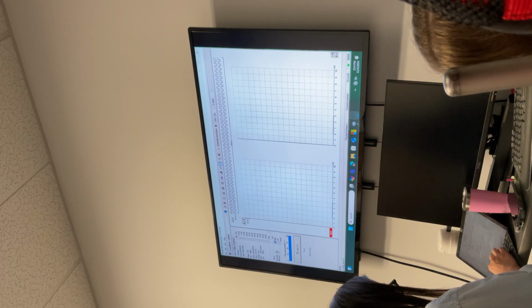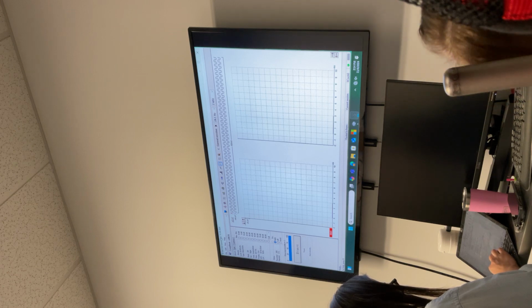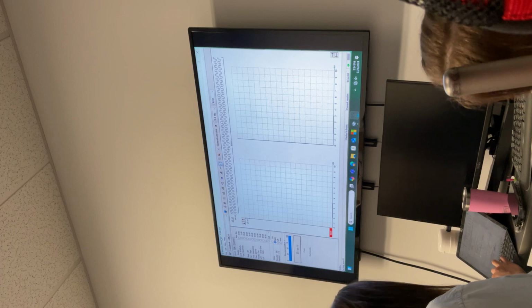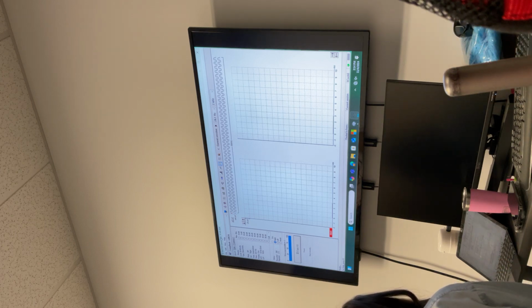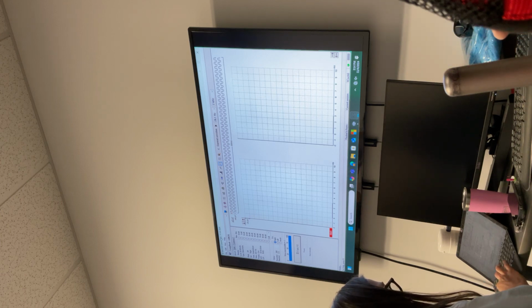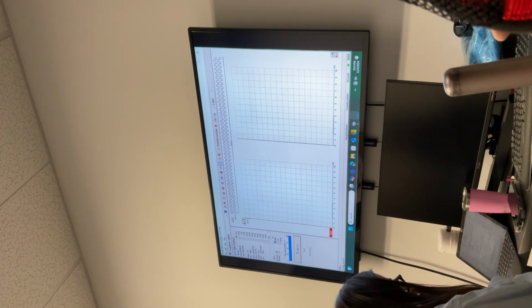So in your lab document, you have this table. This tells you the click latency, wave 5, broadband, and narrowband latencies. You can see they're all very similar. Okay, you can go through this document on the lab page. So this is a must read for this class, this page.